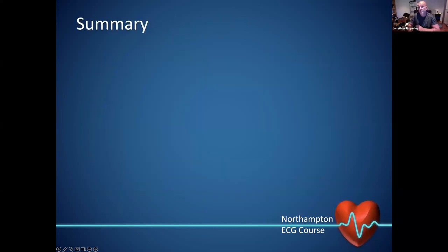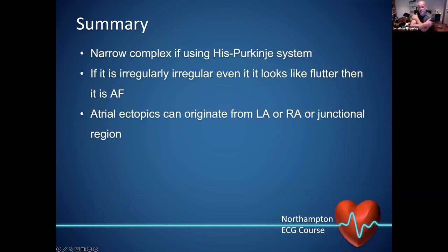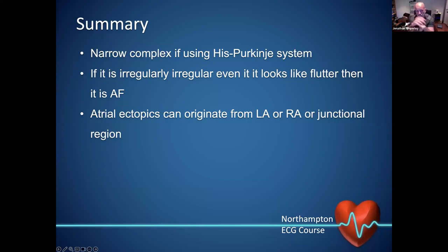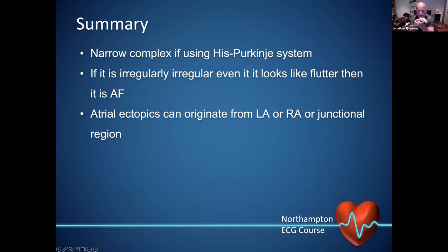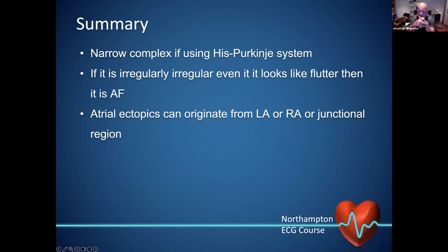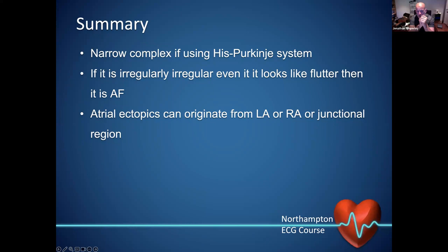To summarize: they've got a narrow complex because we're using the His-Purkinje system. One important point — if you see something that is irregularly irregular but looks like flutter, flutter does not give you irregular irregularity. If it is irregularly irregular, it is atrial fibrillation. And regarding atrial ectopics — if something is irregular but looks like it could be flutter, it isn't; it is AF.